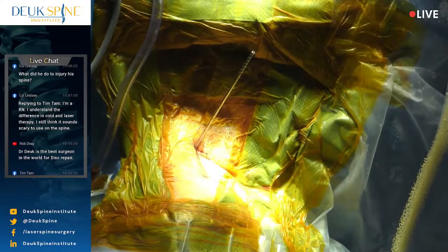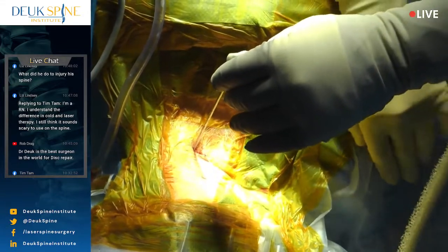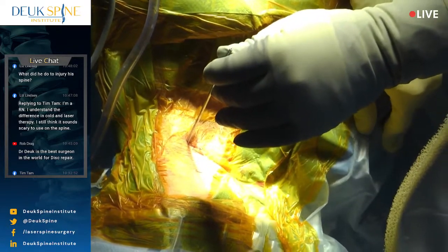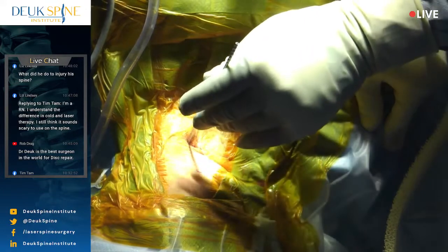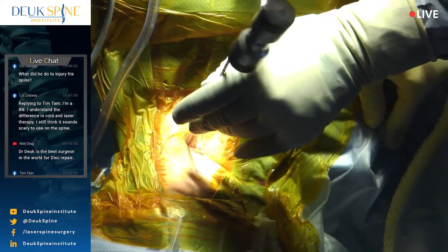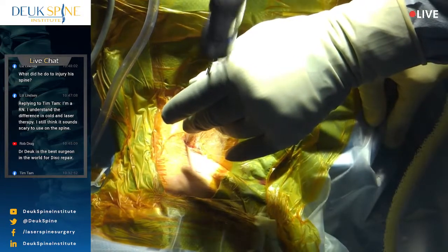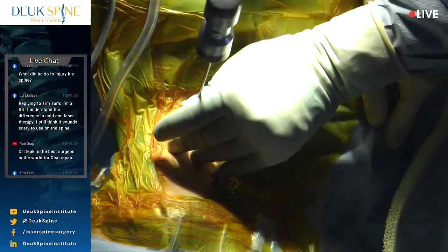You know, if somebody says, oh no, you're at the wrong level, either way, you're announcing the level you're doing so the nurse can check the board and make sure that you're announcing the right level. And then of course you've got people who know how to read imaging and they could tell you if you're doing the right level. And if somebody's opinion differs with mine, we just stop, we reassess before we go any further. So it's just good medicine. Trust but verify, verify, verify.